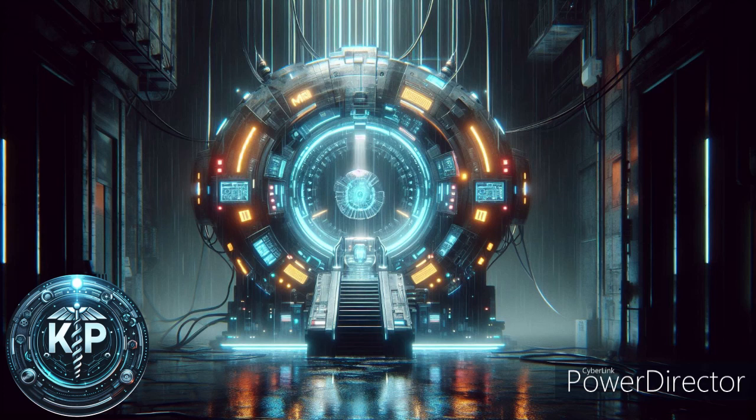Cooling system. High-field MRI magnets generate a significant amount of heat. The cooling system, often using liquid helium, is essential to keep the magnet at cryogenic temperatures and maintain superconductivity.